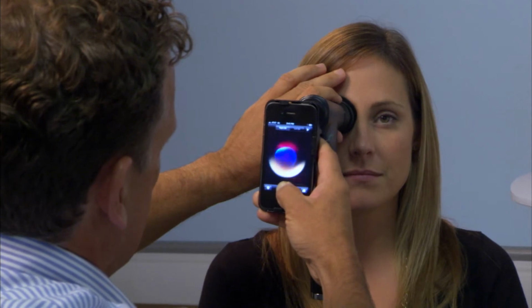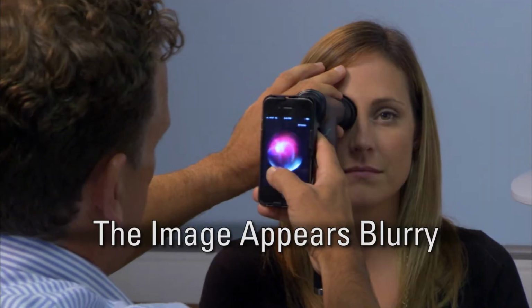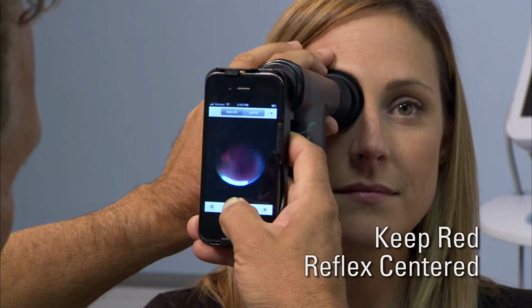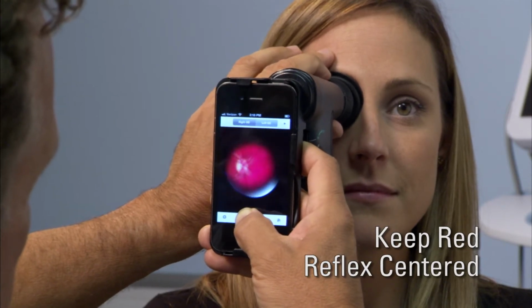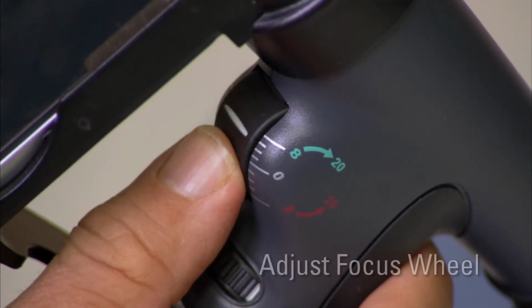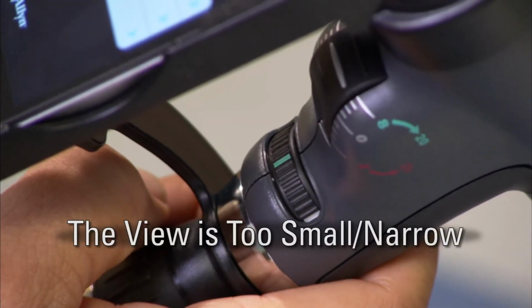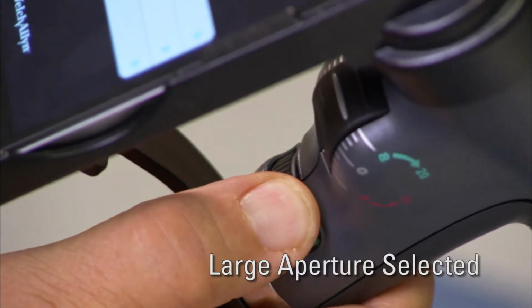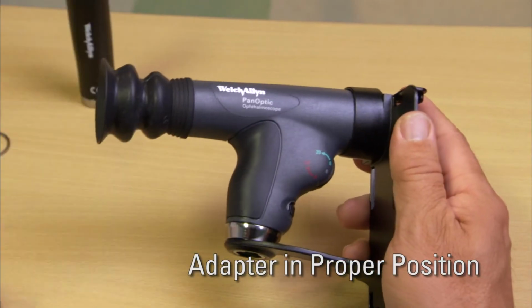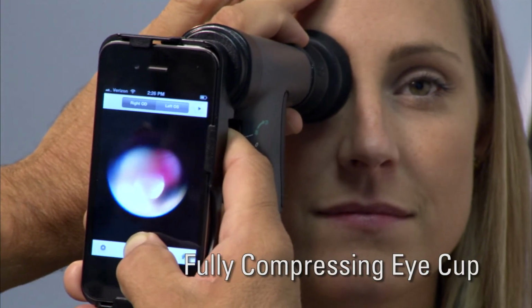The iPhone camera should do all the focusing for you, but if your image is not in focus, try the following. Check to see that the focus wheel is set at 0. Make sure you are keeping the red reflex centered on the screen, otherwise it may be focusing on a different part of the eye. If the image is still blurry, adjust the focus wheel to compensate for refractive error. If the view seems too small or narrow, make sure you have the large aperture selected. Be sure the iExaminer adapter is pushed into proper position on the panoptic and that you are fully compressing the eye cup over the patient's eye.